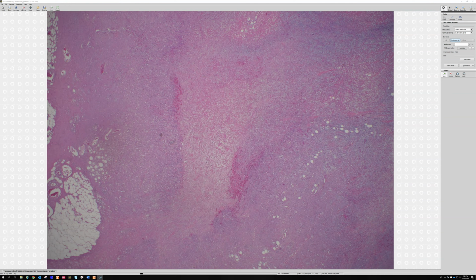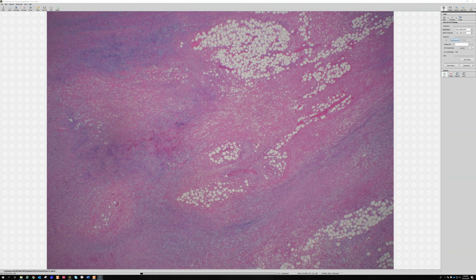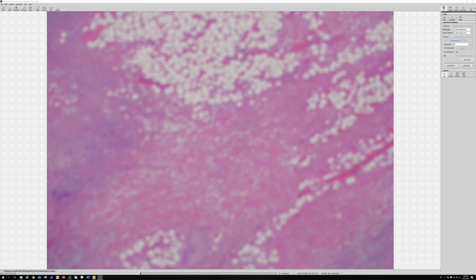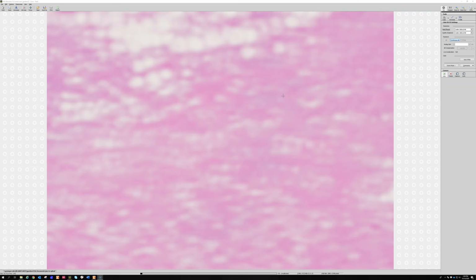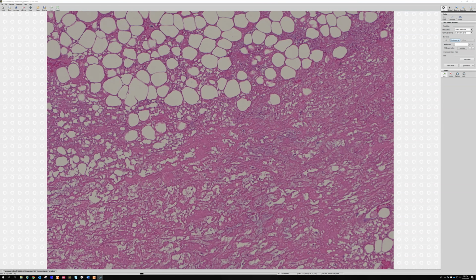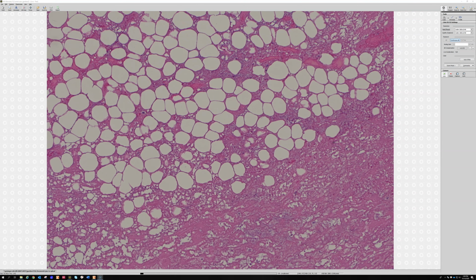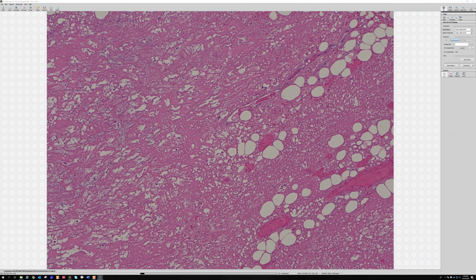We'll come back to the fat involvement in a minute. But then when we go to the center of it, look what something different happens here. In the very middle, we've got a zone that's not bluish and myxoid anymore, but red. And when we go closer, it's all dead. It's necrosis. All the tissue's dead, but it also looks kind of like fibrin. So what we call this is fibrinoid necrosis. I think of it as a necrosis where there's been extra blood bleeding into it, or it looks like that. So it has that bright red color of fibrin, but it's all dead. So it's this kind of fibrin necrosis overlap.